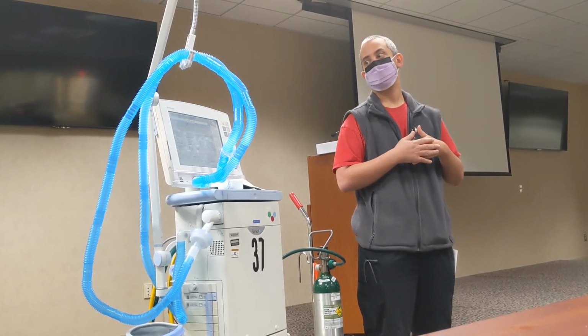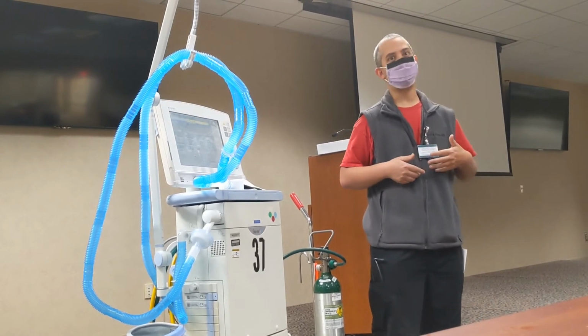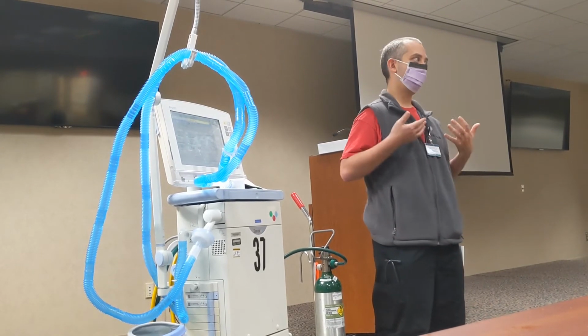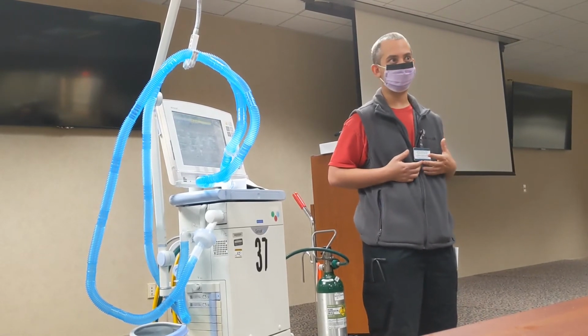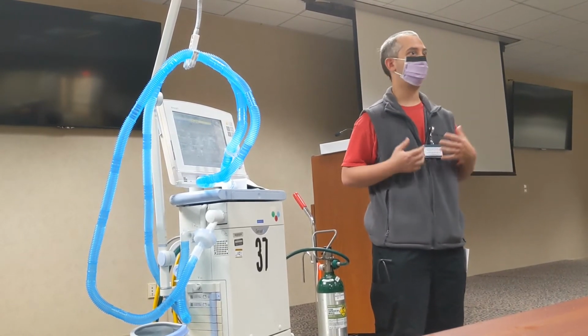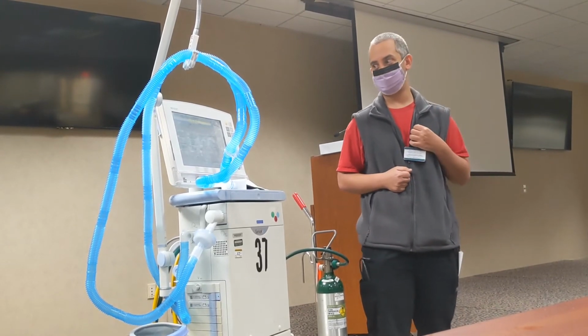And to fix your oxygenation problem, more often than not, you're going to have to go up on your P high, because that's the main driving factor to recruit lung up, to decrease your VQ mismatch and improve your oxygenation.